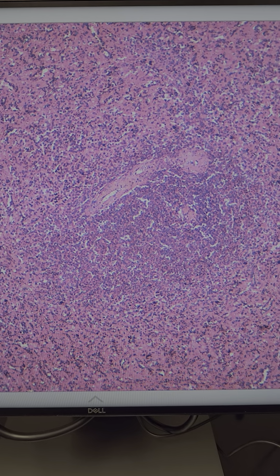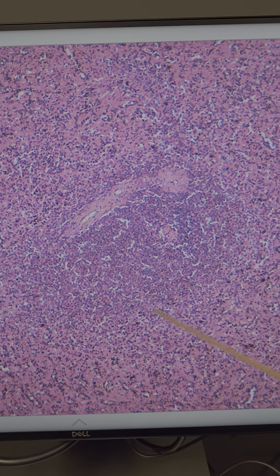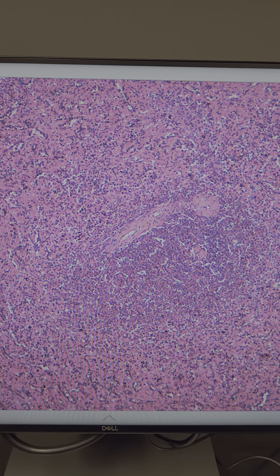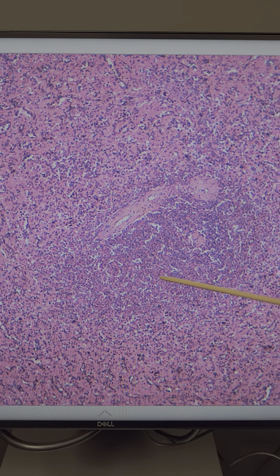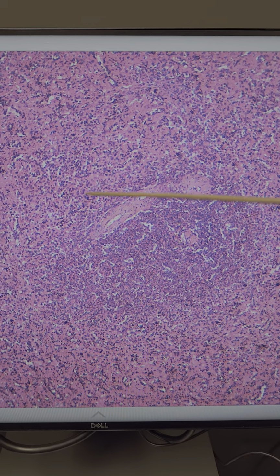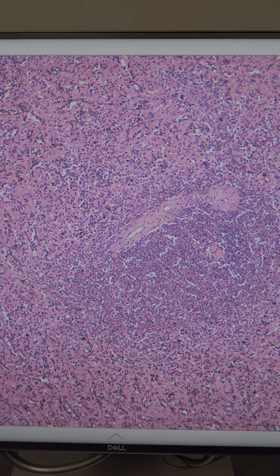In the spleen, here's another slide where we can see the white pulp and the red pulp. So we've got the white pulp with our T and B lymphocytes and the red pulp surrounding. This is on lowest magnification. I'm going to go up one more. And hopefully you can see the difference in this area where we have white pulp and the surrounding area where there's red pulp. So you'll notice that unfortunately this kind of looks like a trabecula. It's not, it's part of a blood vessel, but we don't have trabeculae within this tissue sample. So that will help you distinguish it from the lymph node.